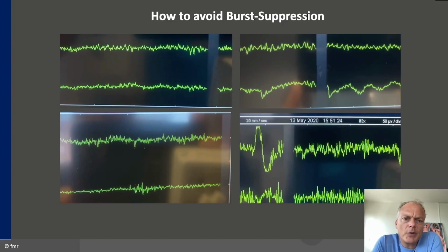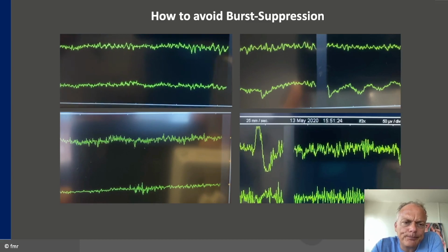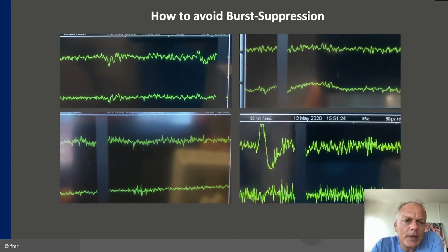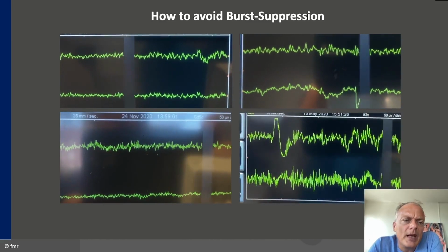And for how to titrate the sedation part of anesthesia correctly, it's hugely helpful if you can take a look at the raw EEG under induction. Here we have different induction settings from 4 different patients. You can see in the beginning the very typical beta-dominant rhythm in all 4 of these induction scenarios. And when you apply the sedative part, you can see the very typical changes from the beta-dominant rhythm.